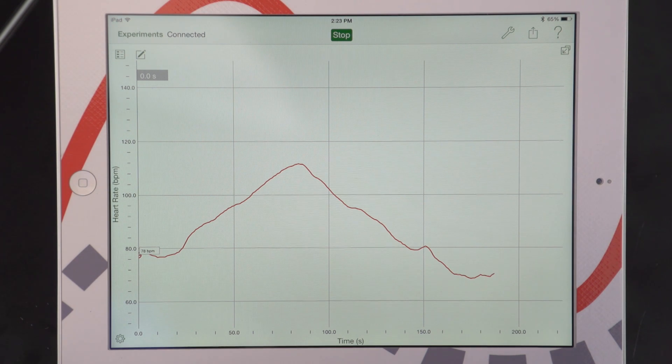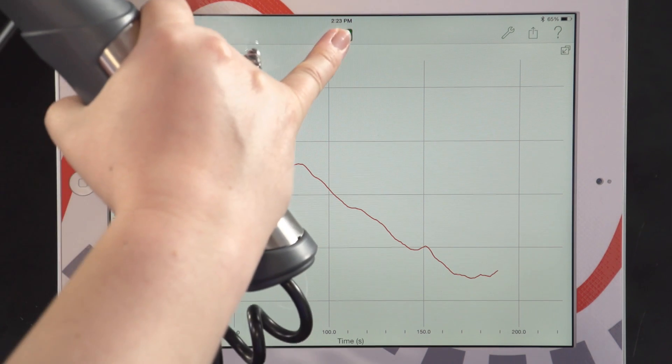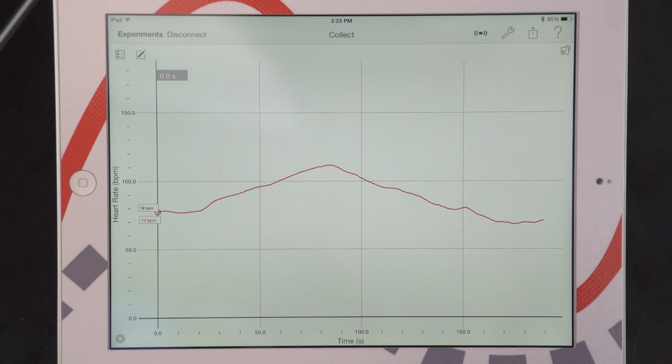Now that my resting heart rate has stabilized, I'm going to go ahead and press stop. And now I have my data for my first run.